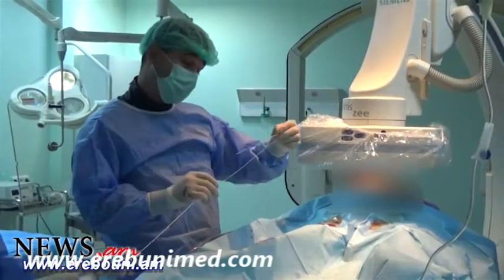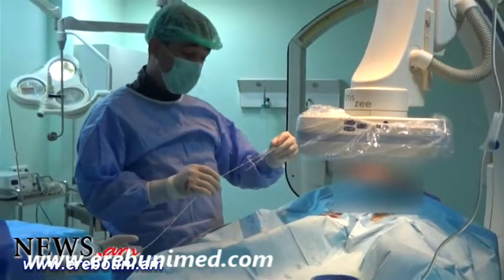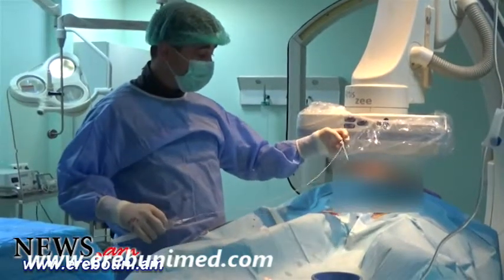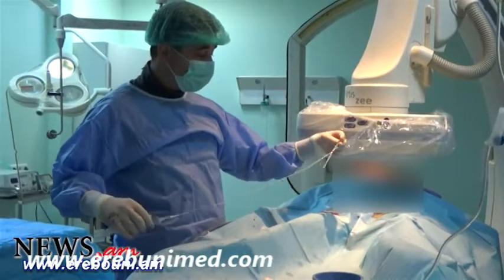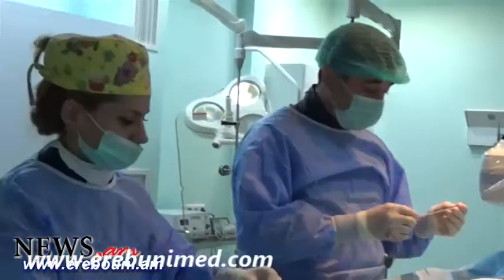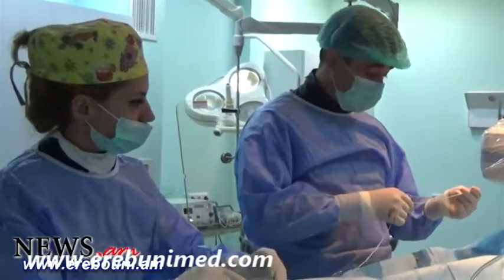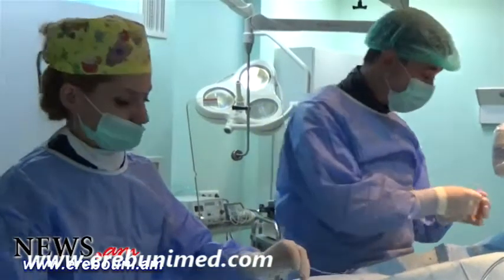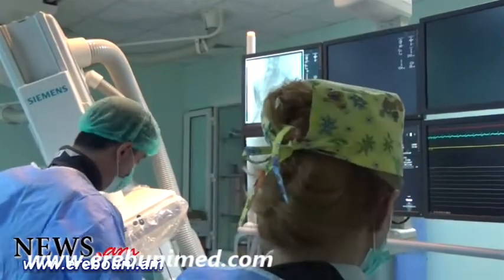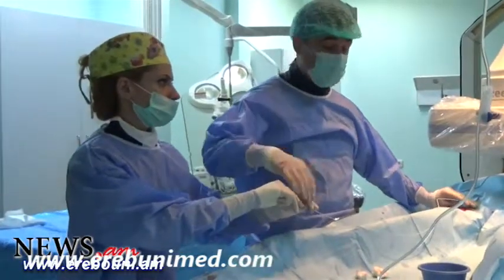It is already 20 years that this endovascular surgery has been carried out in developed countries. In the USA, this method has been used since 1996, and in Russia it is included in a list of intravascular surgeries. Under angiographic control, we find the uterine artery, which has a spiral shape by which we recognize this artery. And now, as you can see, we entered into the left uterine artery and should carry out a selective angiography of the left uterine artery.